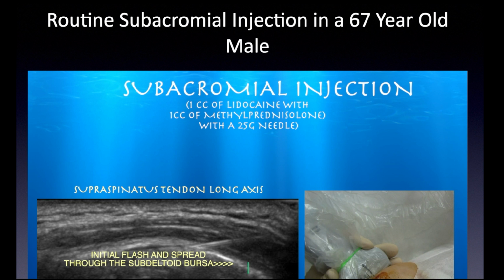So whenever you're doing an injection with a needle that's close to the probe, you want a sterile probe cover, sterile gel. It's good to drape the site, so it's almost like a surgical procedure where you don't have to worry about if your probe goes a little bit away or glides over, you're still actually keeping the probe sterile.